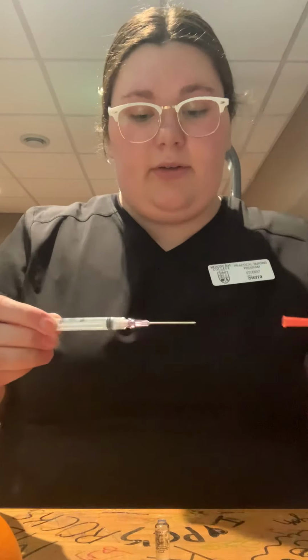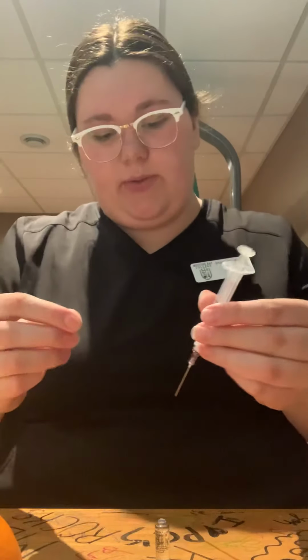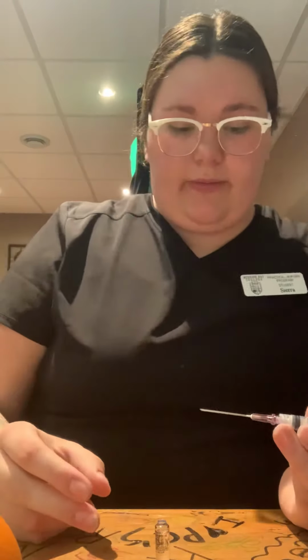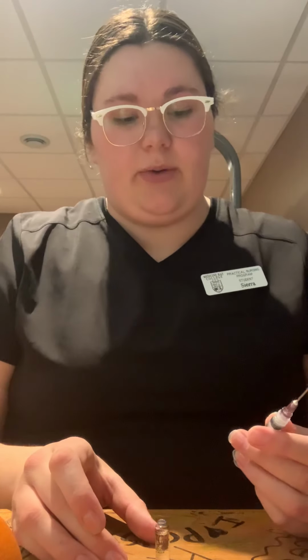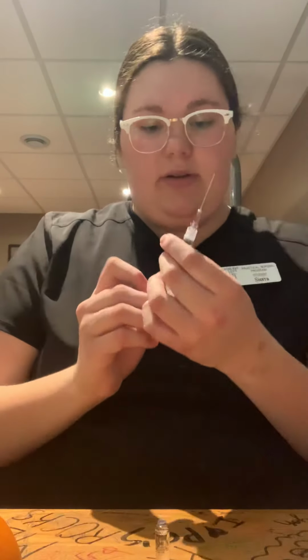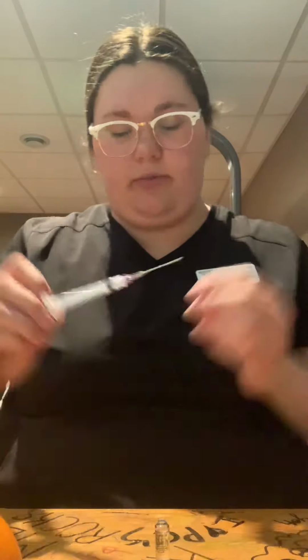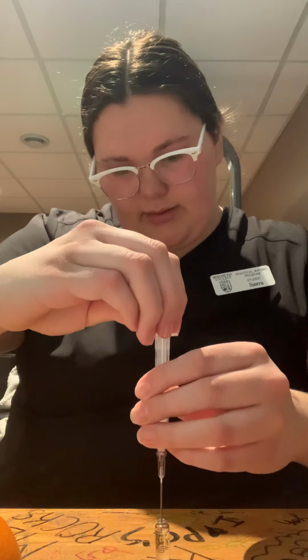Now we're going to remove our lid from our filter needle without contaminating, putting it straight down into the morphine and getting out the desired amount we need. Because the doctor's order said 5 milligrams of morphine, our amps come in 1 milliliters, which equals 10 milligrams. So we are going to be removing 0.5 milliliters of liquid into our needle. So we're going to remove 0.5 milliliters.